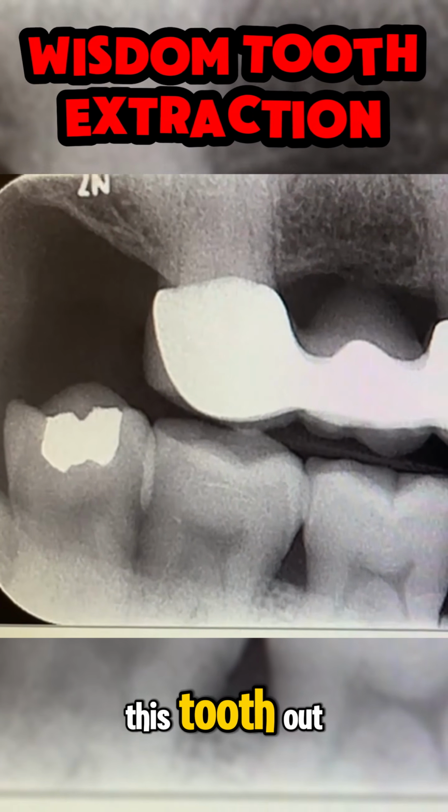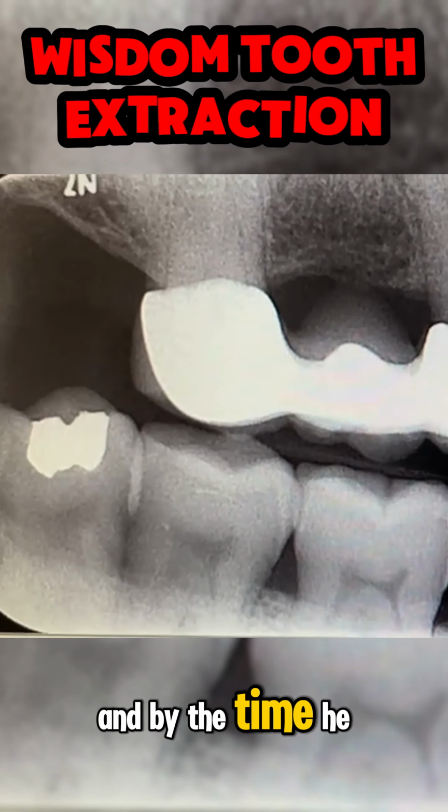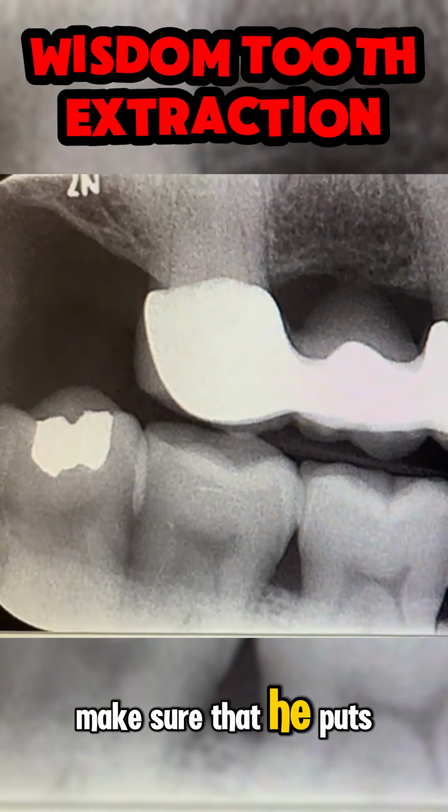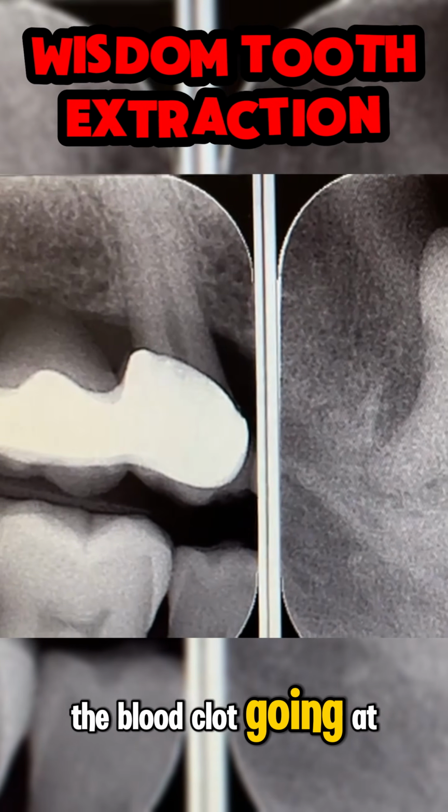going to pull this tooth out, and we're going to use the anesthetic. And by the time he goes home, make sure that he puts pressure on that tooth so that we can get the blood clot going at the end.